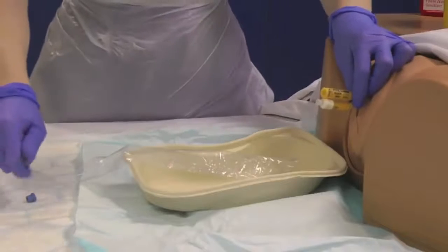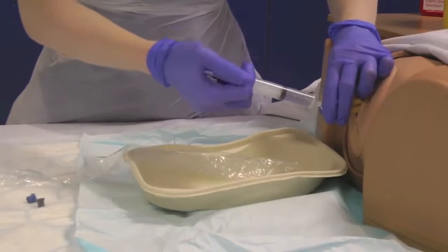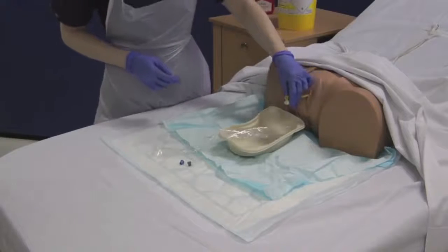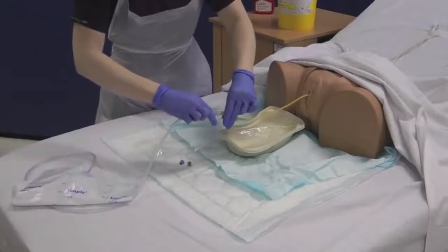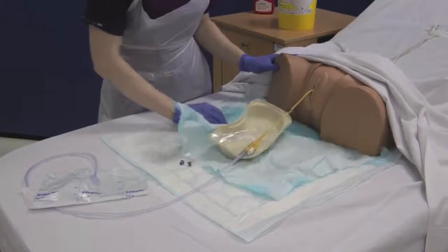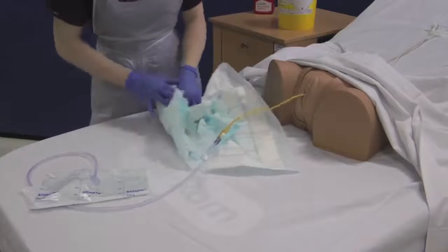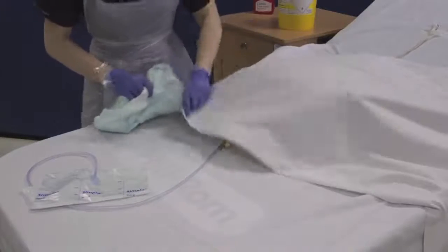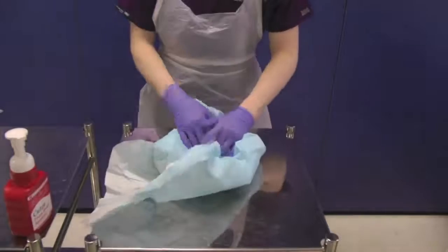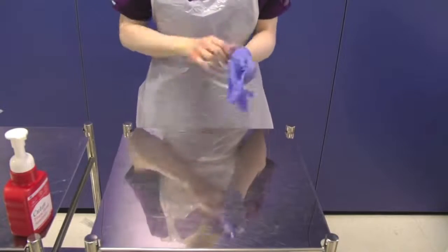Take your 10ml of sterile water from your sterile field and inflate the balloon, observing the patient for any signs of discomfort. Dispose of the syringe into the sharps bin. Once the balloon is inflated, withdraw the catheter gently to ensure it is secure against the bladder neck. Connect the selected drainage bag, which can then be attached to the patient's leg or catheter stand. Remove all waste material, cover up the patient and return to your trolley. Wrap up and dispose of any remaining clinical waste. Remove your gloves and apron and decontaminate your hands.